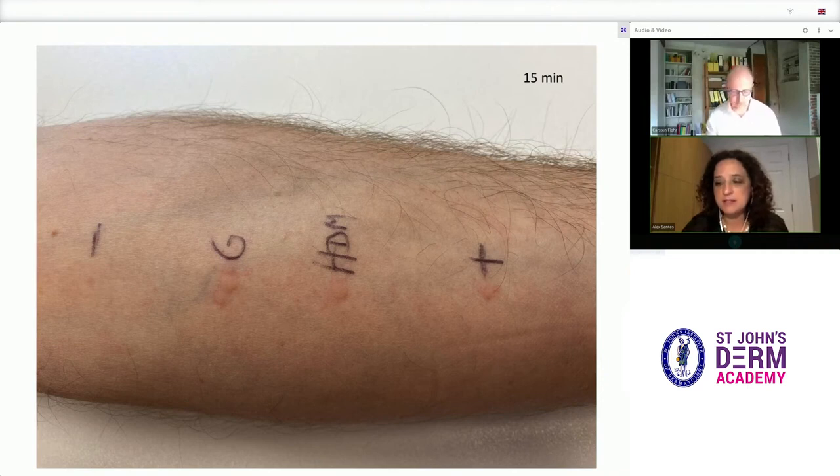At first glance, it is clear that there's no reaction to the negative control on the far left, and there's a good wheal at the positive control on the far right, which means the test worked. The negative control is important as it excludes dermatographism, which if present, makes the tests difficult to interpret.